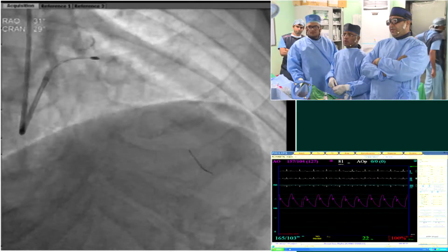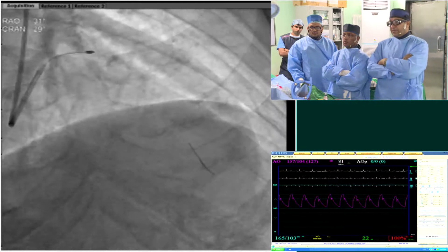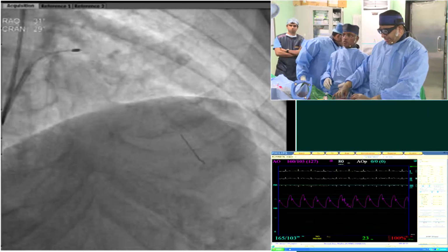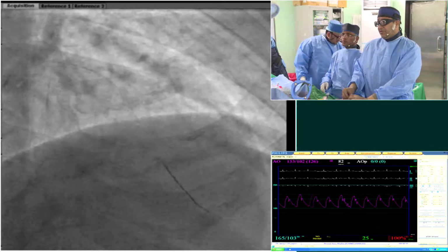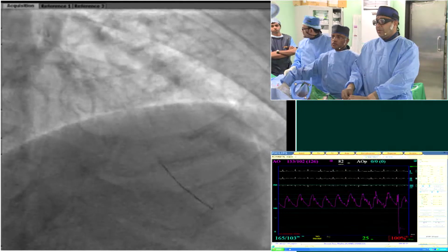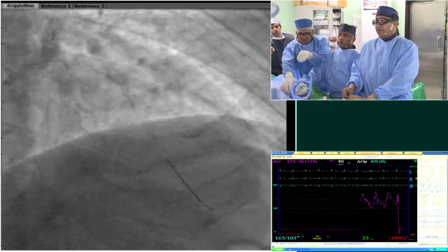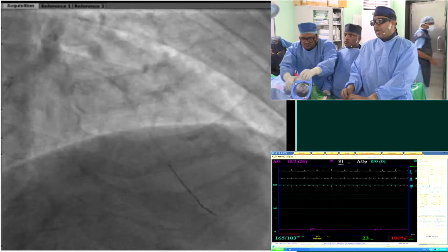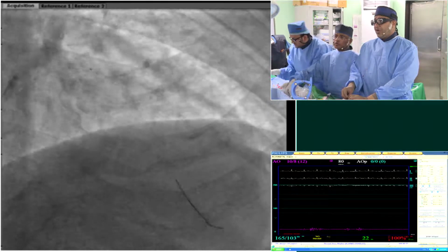That's a 1.5 burr. Now I'm going to put an OCT catheter through the LAD lesion, and let's see how it looks now. In the meantime, do you have any questions, or what do you think is the plan we should follow? Since the lesion was very tight, were you able to wire with the rota wire? No, I wired it with a regular Runthrough NS wire. Since I couldn't pass the OCT or anything else, I thought let me exchange it with a microcatheter. So the microcatheter went easily.